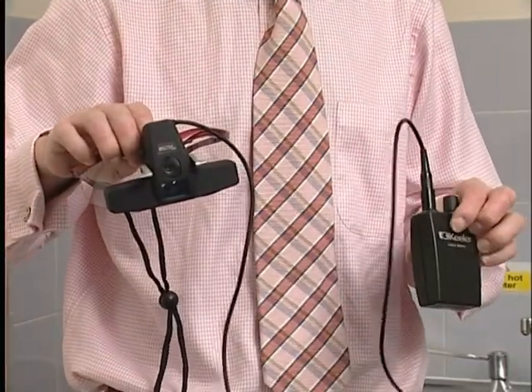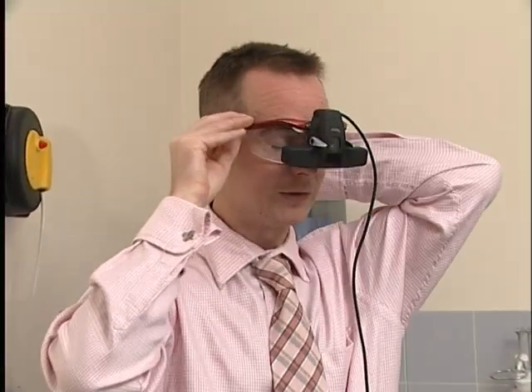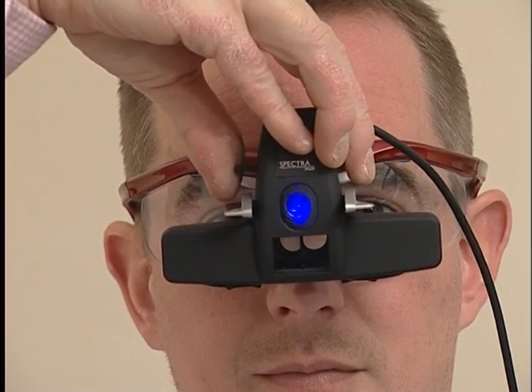There is a simpler version of the head-worn indirect ophthalmoscope, which is worn on glasses and has a separate back-worn battery pack. There is less selection available on the light sources, but this simplification is reflected in the price.